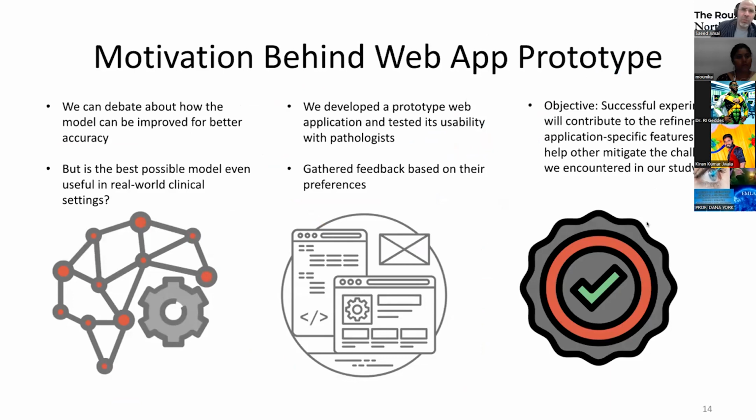So we can think about which model is performing better than the other, but still in the real world we want to evaluate the usability and how good these models are performing, how usable, how easy to communicate the outcomes of these models with the clinical team. And it could be, of course, any other domain where we develop AI models and we want to communicate the outcomes with the user or any consumer of these AI models. So we developed this model, and then we gathered feedback from pathologists and medical practitioners, and then we evaluated that.